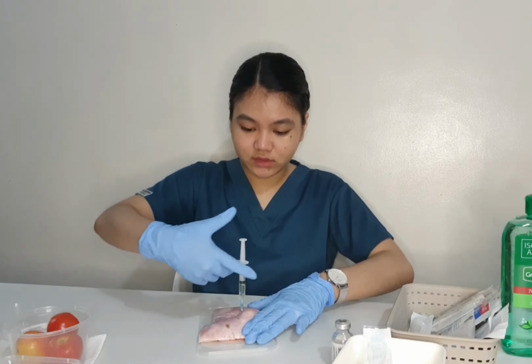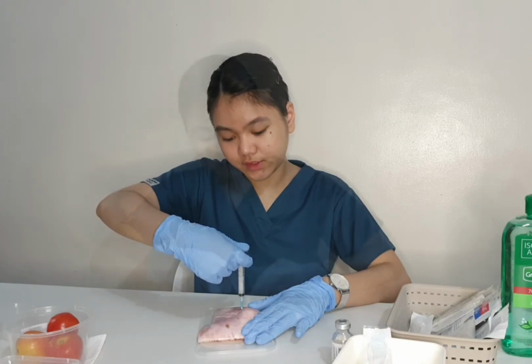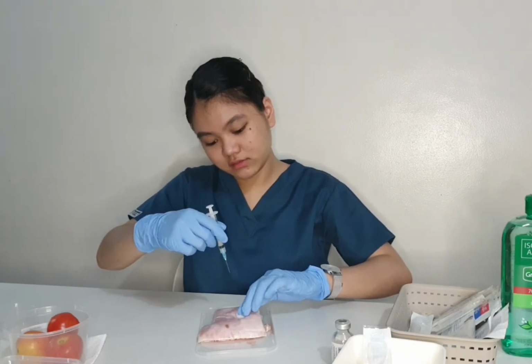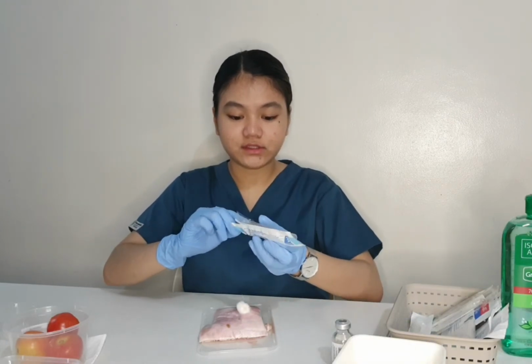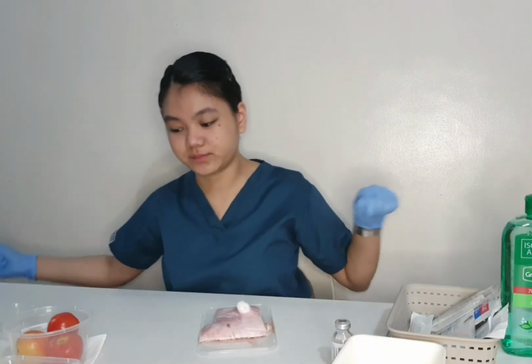And then push the medication. So let's just push it slowly. And there you go, and slowly get the needle. Okay, there you go. And then after that, we can now remove the needle again. Make sure that you will not get needle prick and throw it in the sharp tools trash bin. And the syringe is in the proper disposable bin.